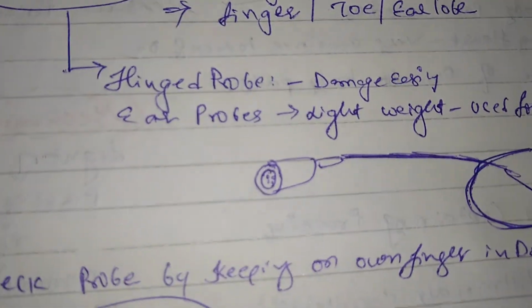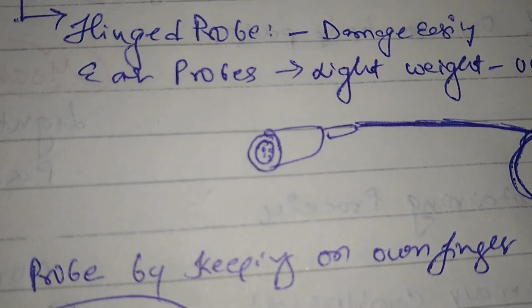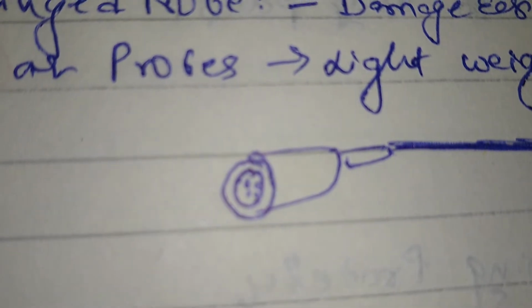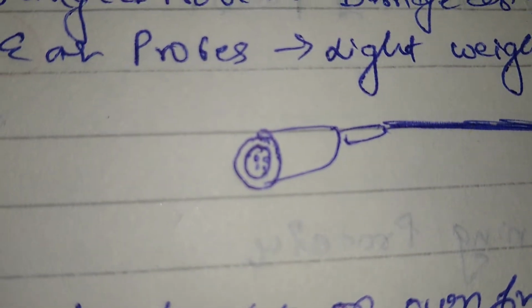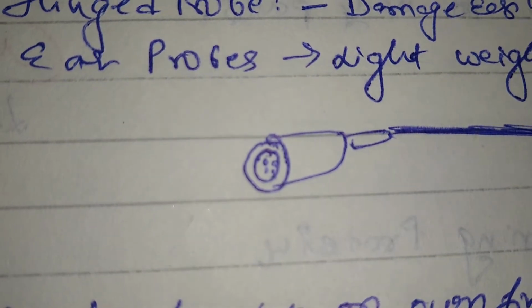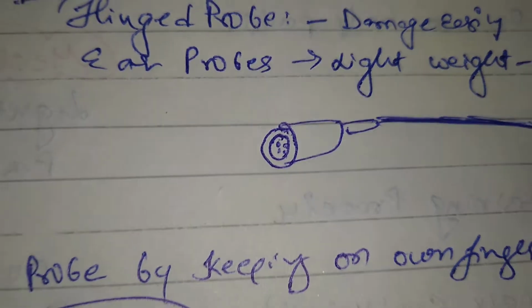And we can see here the electrical connectors which we are going to connect to the monitor. These should be handled very carefully, and adjusted in such a manner that they do not get damaged. If they are damaged, we automatically cannot see the SpO2 reading.